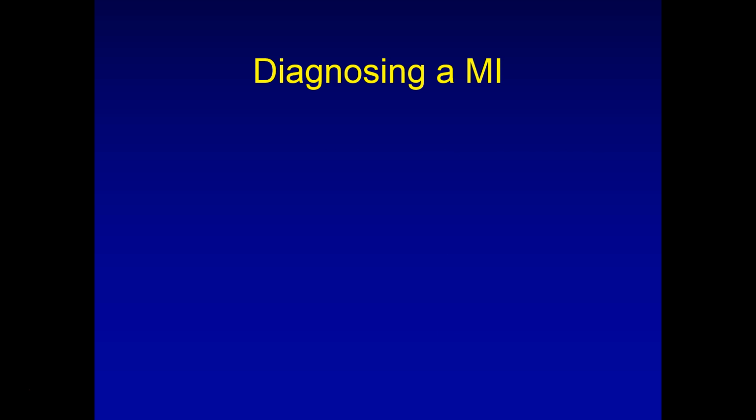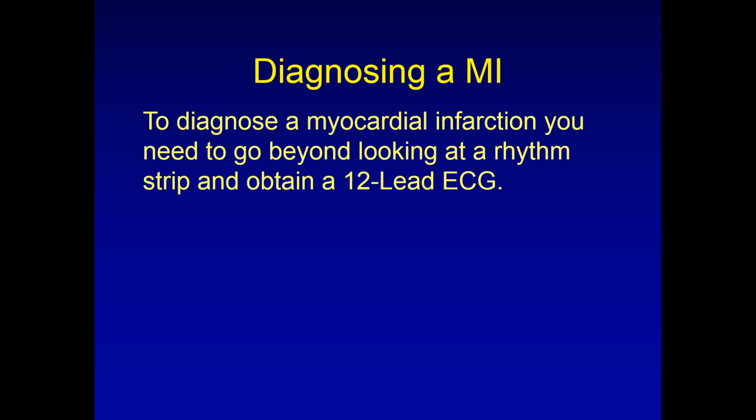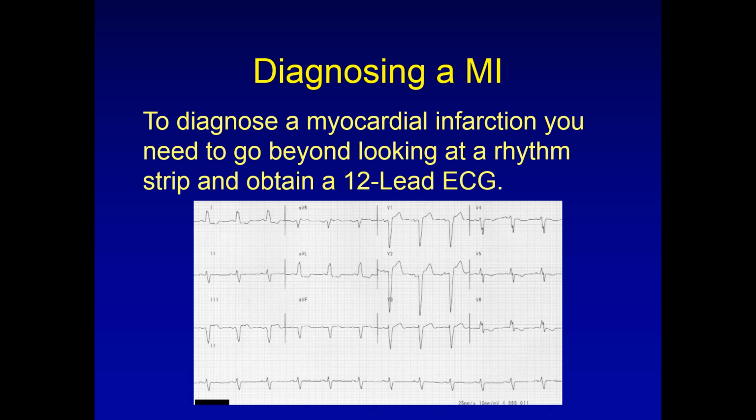Okay, diagnosing an MI. You need to go beyond looking at a rhythm strip. You have to obtain a 12 lead. Let's take a look at a 12 lead. Okay, that's your standard 12 lead.